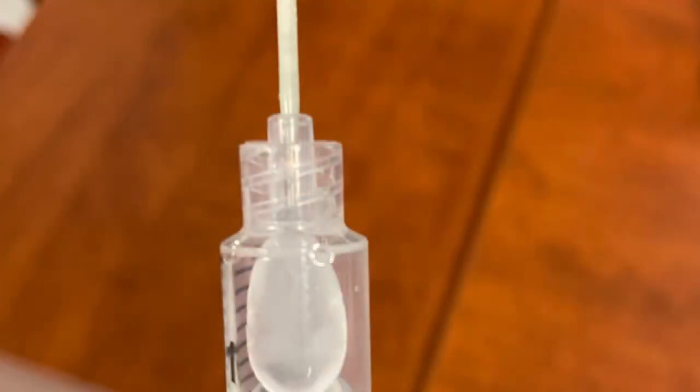Here is an example of a fully formed ice ball that will cause the Wallerian degeneration of the nerve. I think it's quite beautiful.